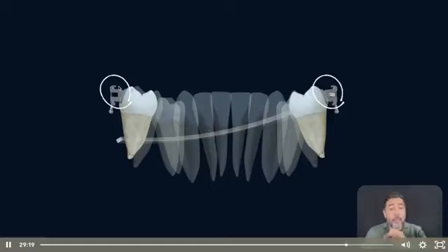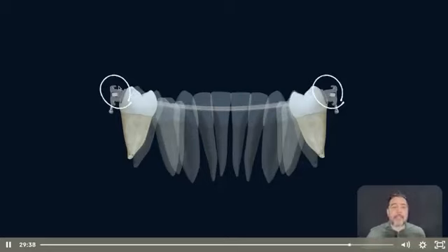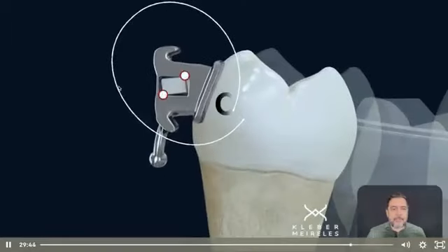We have a full engaged system here, in which we insert the wire inside all brackets. The entire system is restrained. So this is a little bit different. I'm going to show that to you, because this is a very common doubt that we see when we apply this. But again, I'm just philosophing here.